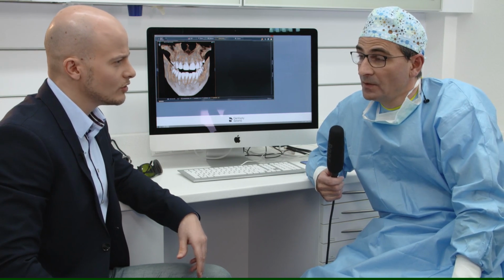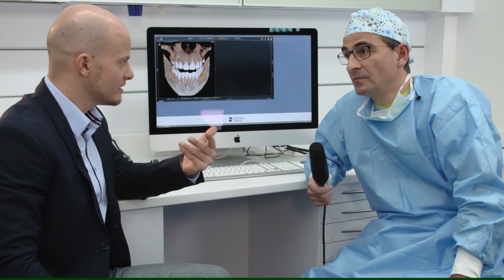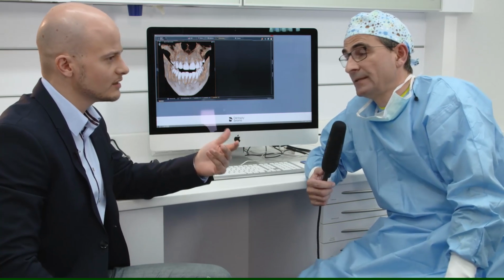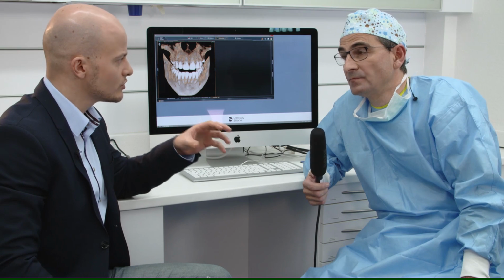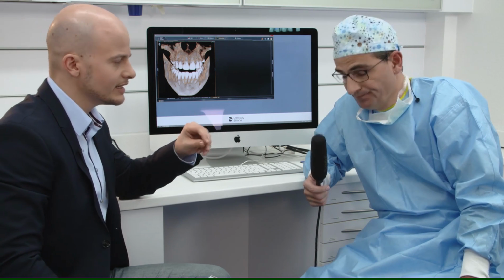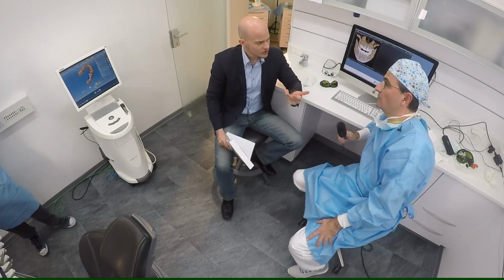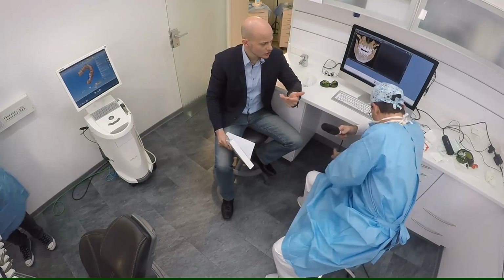I commented on this already. We were talking about this in advance, that the bone augmentation, or let's say the socket preservation, was done elsewhere, at another clinic. And you never know what osseointegration you will find. It also depends on the regeneration potential of the patient, right?